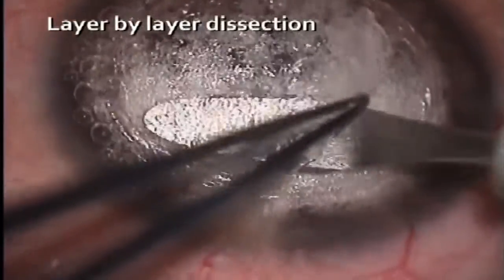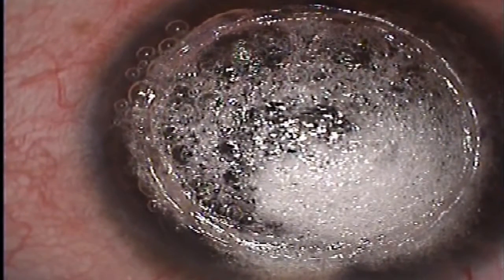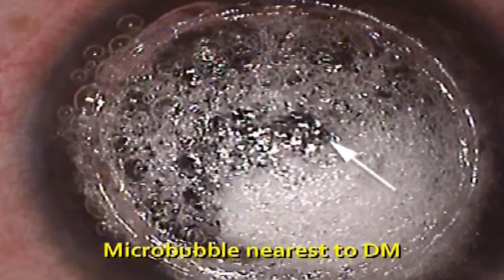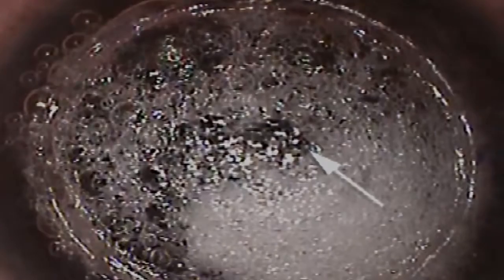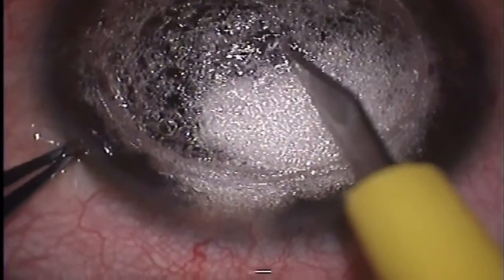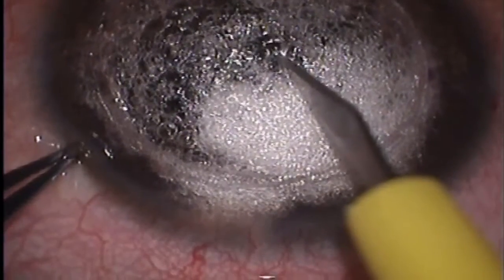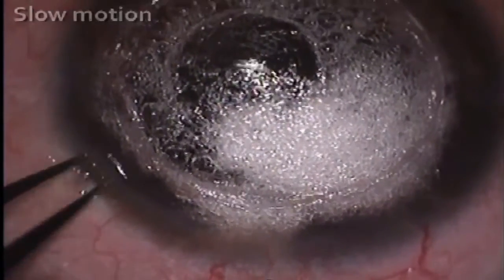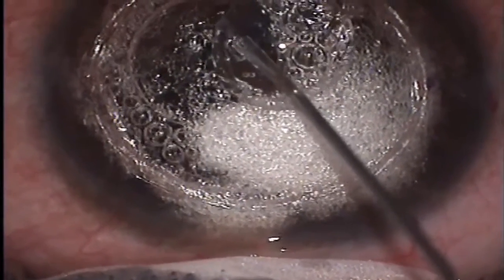Layer-by-layer dissection was then carried out. The microbubble nearest to the Descemet was identified and punctured. Viscoelastic was injected to detach the Descemet from the rest of the stroma.